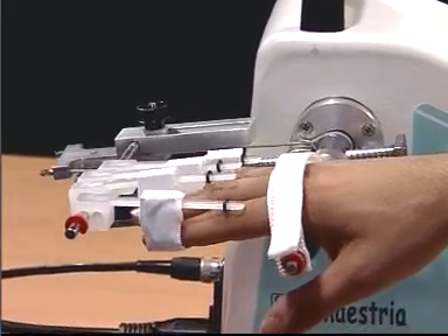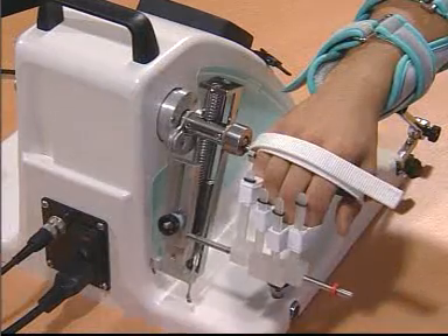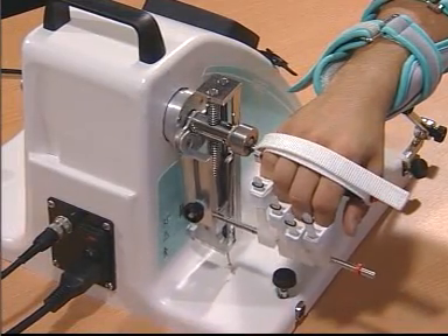And we begin the movement. The settings can be obtained up to 270 degrees of flexion.